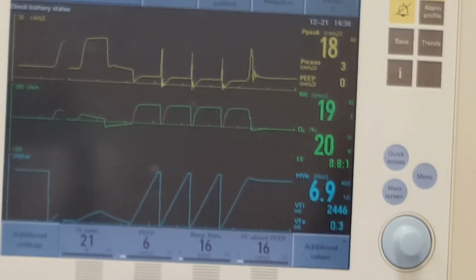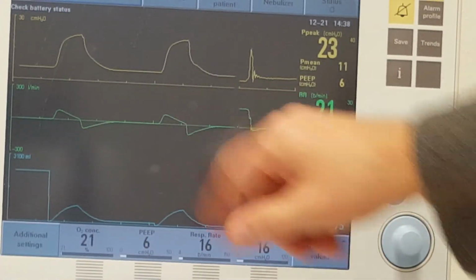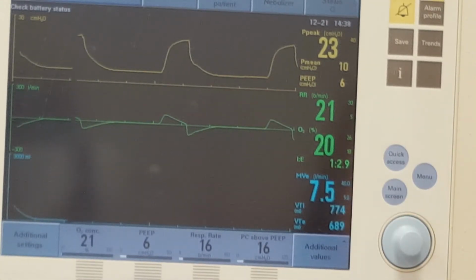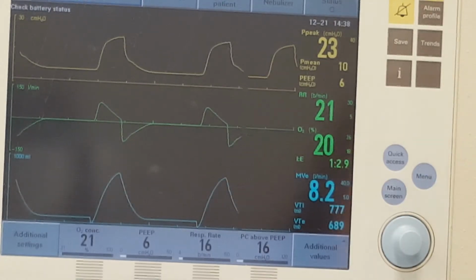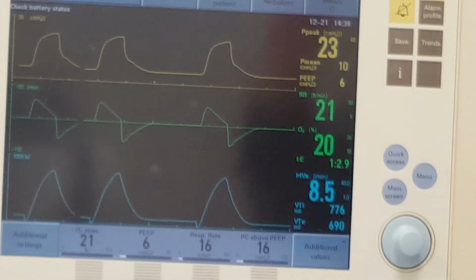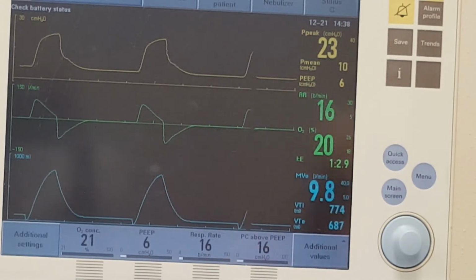and you'll see again the increase in volume associated with moving from 20 to 5 of Raw. So we've taken off. Notice how our peak flow now is almost to baseline at the end of inspiration, where when our Raw was 20, we were ending much further up, because it's so hard for air to pass through the tiny little hole associated with a Raw of 20.